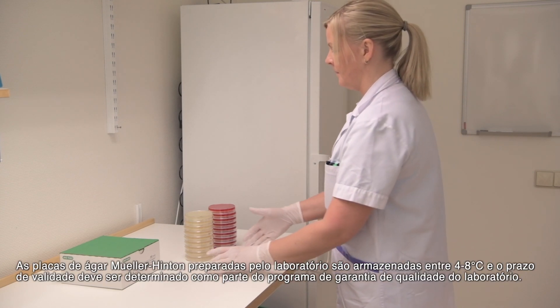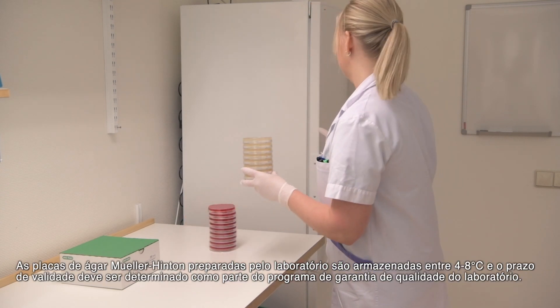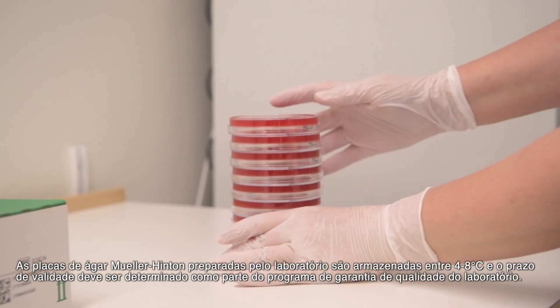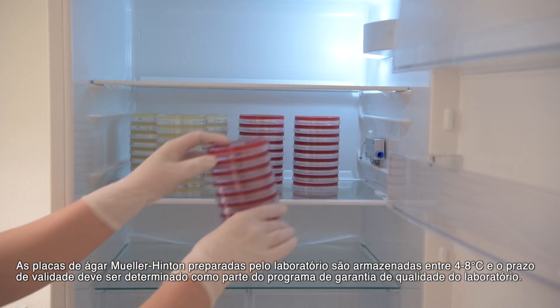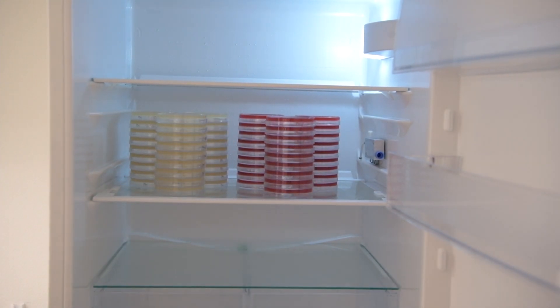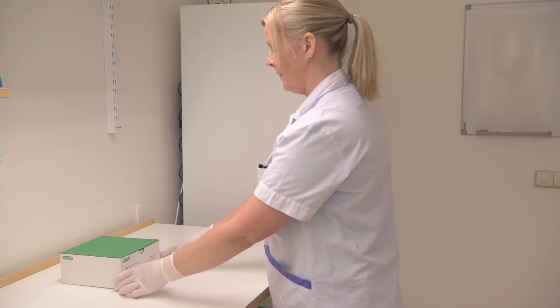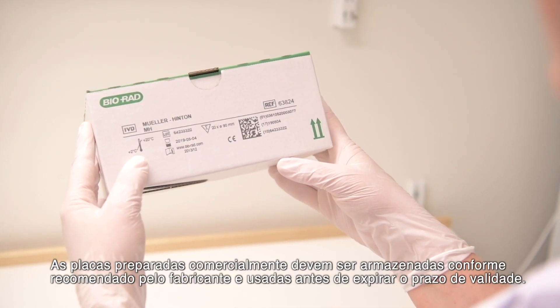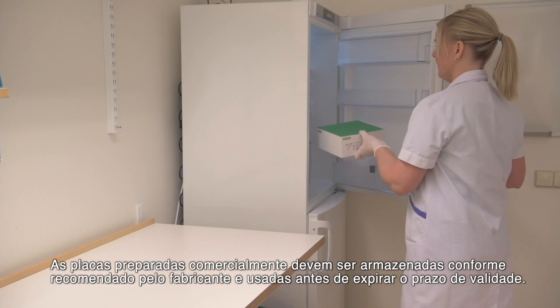In-house prepared Muller Hinton agar plates are stored at 4-8°C and the shelf life should be determined as part of the laboratory quality assurance programme. Commercially prepared plates should be stored as recommended by the manufacturer and used before the expiry date.